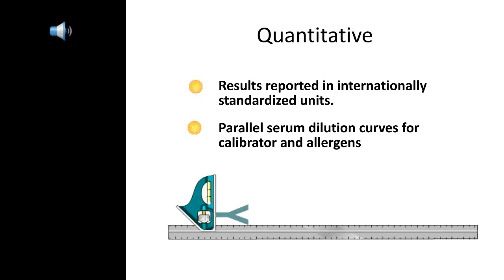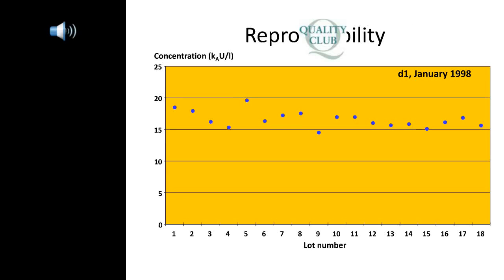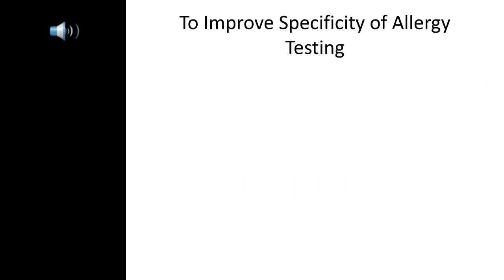So firstly there was increased sensitivity, but secondly you could increase it to an extent that you could now in fact do parallel curves with total IgE and lead to a quantitative test. And this has in fact improved things. Essentially also you could do quality control testing, and you could get reproducibility between labs, and we have locally our RCPA external quality control, and stuff like that.